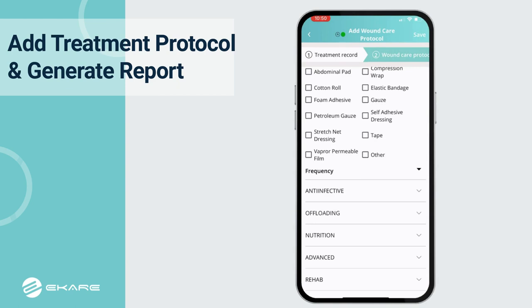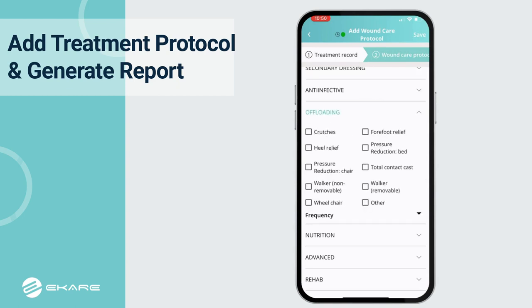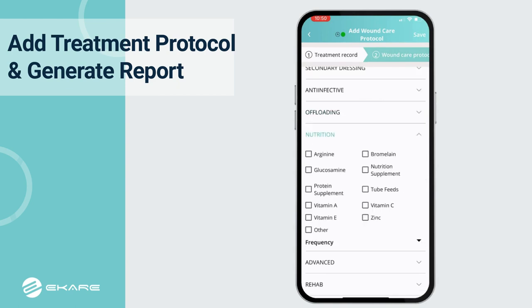Users can also document anti-infective, offloading procedures, nutrition, and much more.